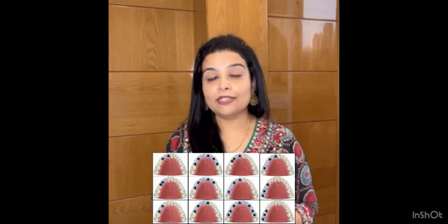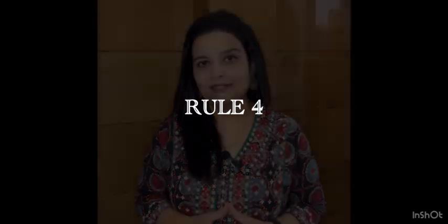Rule number 3. Canines and first molars are the most important key positions. That is, if you are replacing multiple clinically missing teeth that also involve the canine positions or the first molar positions, then you need to place implants in the canine positions and the first molar positions, whether or not they are the terminal abutment positions.